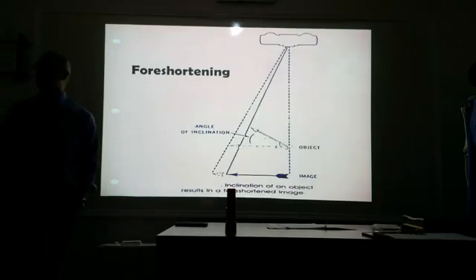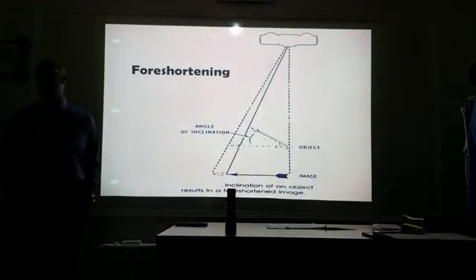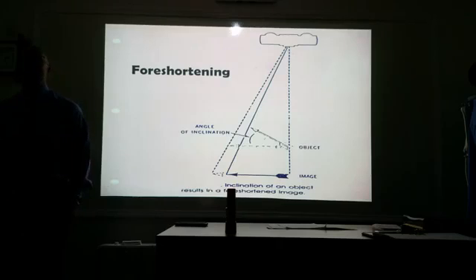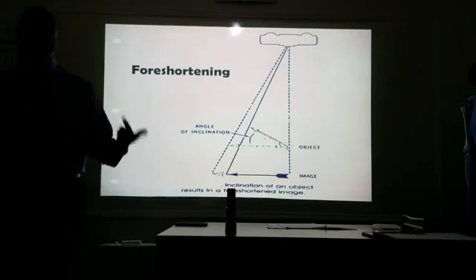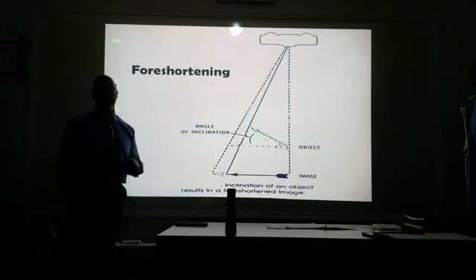So foreshortening occurs when there is an inclination of an object. This is called foreshortening. So you get elongation with tube or image receptor angulation. You get foreshortening when there is angulation of the body part. Elongation with tube or image receptor. Foreshortening with angulation of the body part.